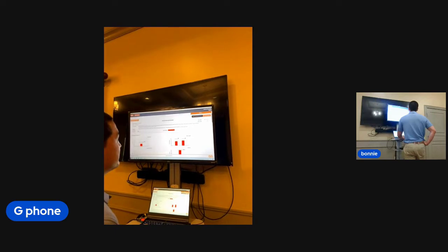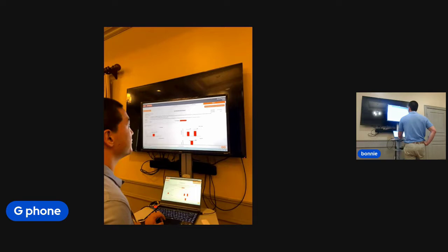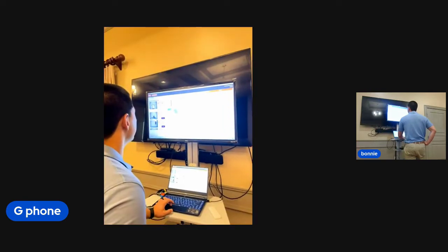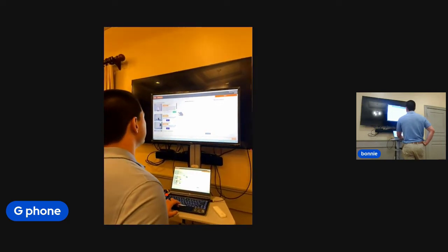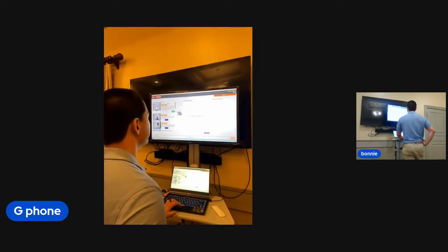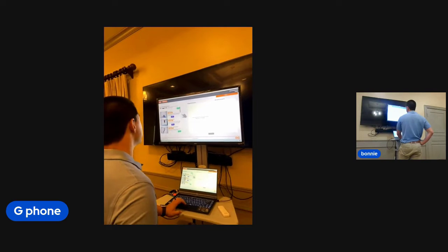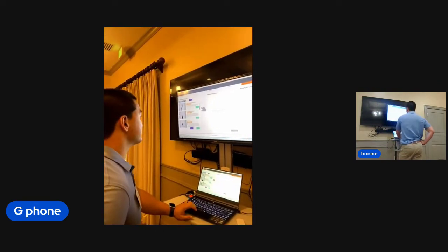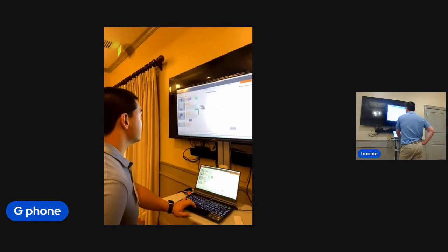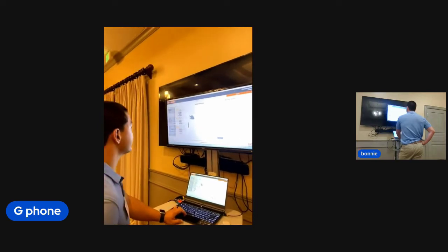And then at some point on this report, they also have recommended exercises, which is a neat tool, which we already kind of do. Based on my scores on the standing balance, it recommends this exercise, and I can add it into this client's home exercise program already. Like, okay, they did poorly on the 5 times sit to stand. Let's work on a couple of stretches that will help improve their mobility to make that test a little bit easier. They have a whole list of them, and I can pick and choose the ones that I like best and go from there.